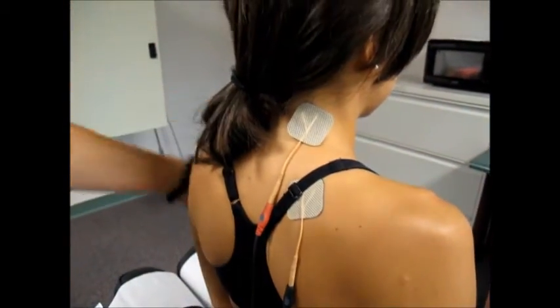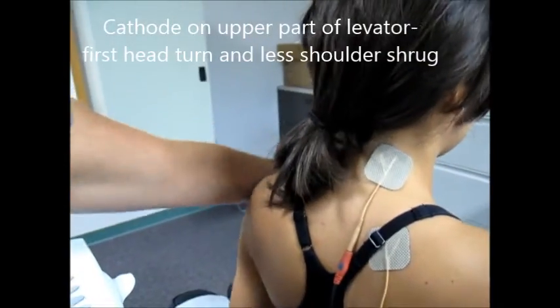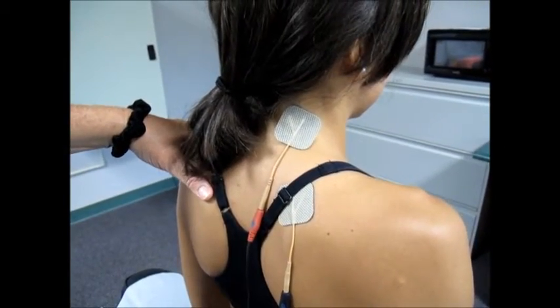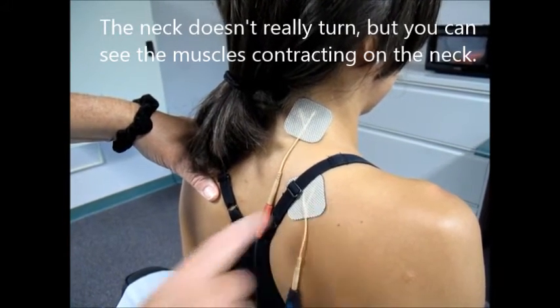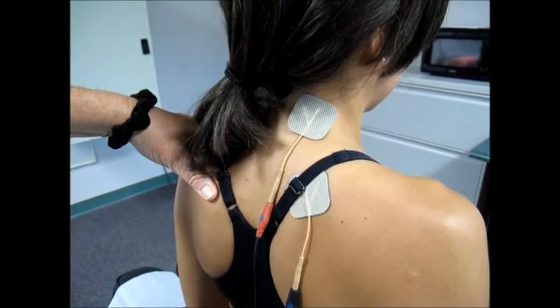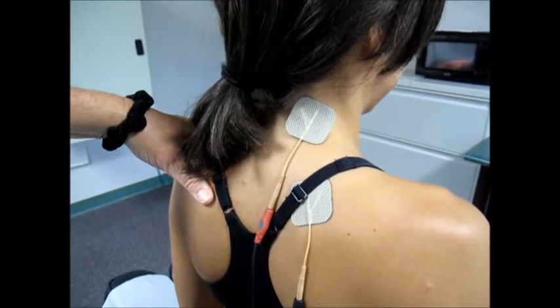Let's go ahead and come over to the patient. I'm going to be turning this up — you can just dip your hand down when it's too much. Go ahead and raise your hand up when you feel it. You're at 60 volts right now. Can you see the twitch right there? We have her at a hundred cycles per second. See how her whole neck is turning and her shoulder is shrugging.